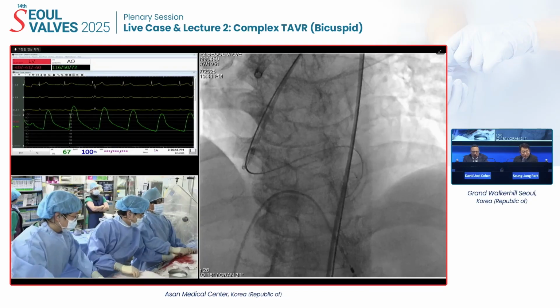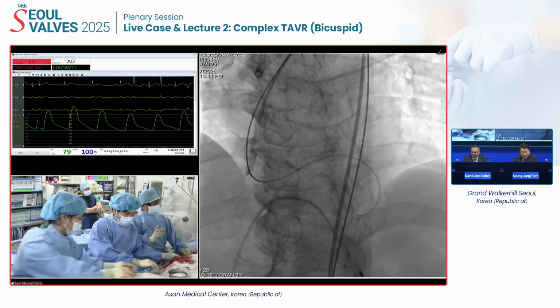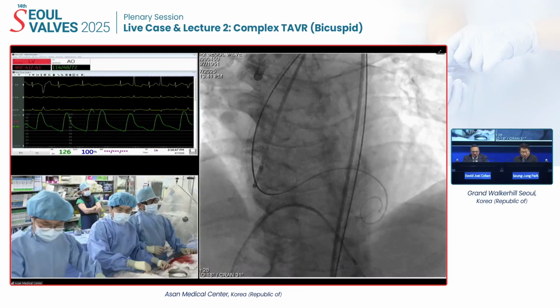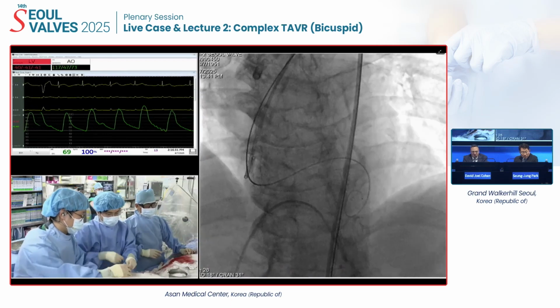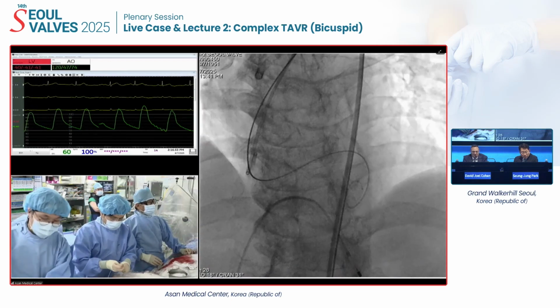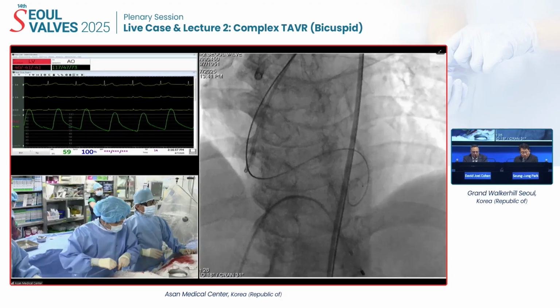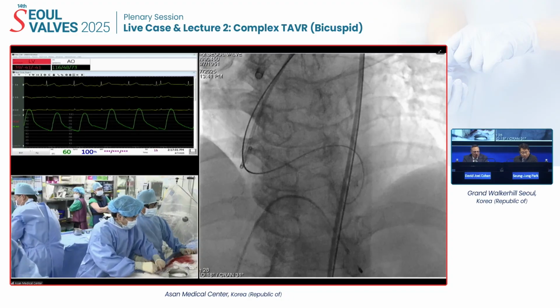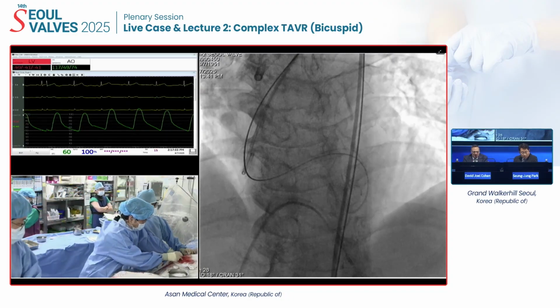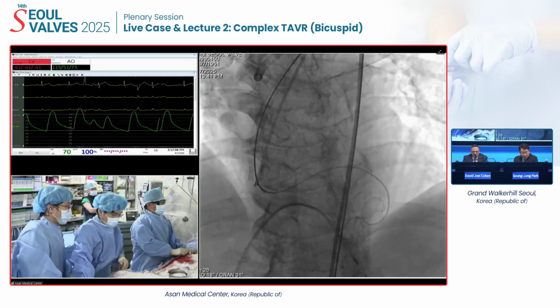And you take care of your wire. Don't worry about us. So with very low aortic valve calcification, the oversizing is similar to the tricuspid aortic valve type of cases, so 5 to 10%. So in this case, that's why you're comfortable with a 10% oversize. Yeah, because the calcification is very rare. But I'd like to replace the wire using the pigtail. Good idea.